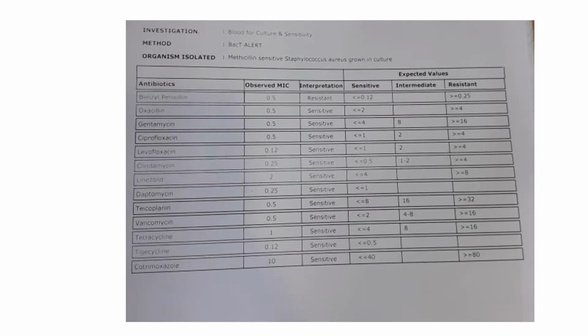If you are seeing these drugs even mentioned in the report with identification as a gram-negative organism, any gram-negative, then that lab is not good. So any good lab should not report, or even mention, these antibiotics in their report. Even if they say, okay, these antibiotics are there and they're resistant, it's not the way they should report any of these things. So these antibiotics should be mentioned only if you are talking about a gram-positive bacteria. So this is how it is.